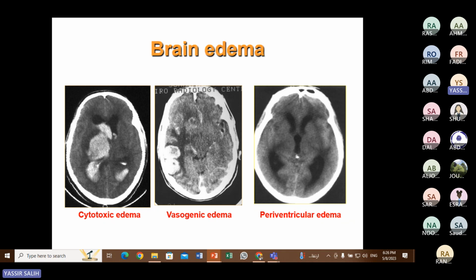Try to report what your findings are. Imagine you have a CT: you first talk about the technique, for example this is an MRI, or a chest X-ray shows or demonstrates such and such findings. Try to talk about how to describe the abnormality.